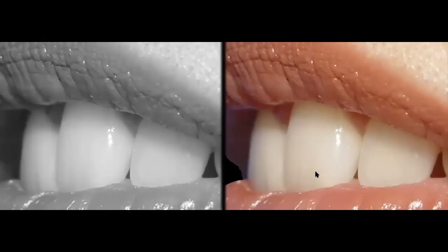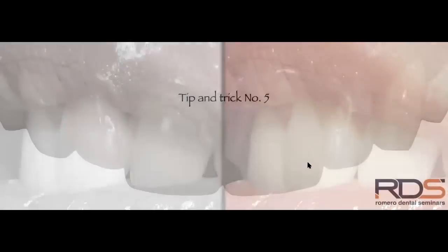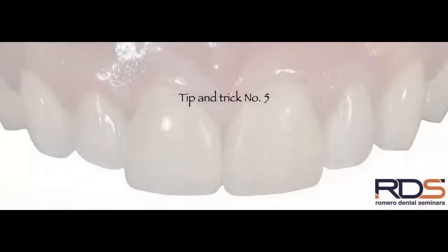But most importantly, what we want to show you is that you are able to reproduce all these natural features within the tooth by using a layering technique. And again, by understanding that the decision is made based on the color mapping that you obtain.